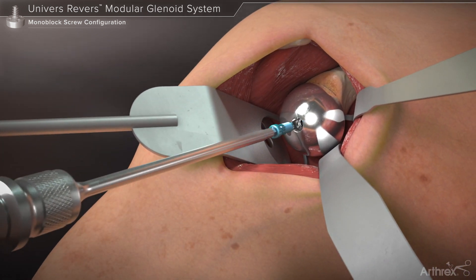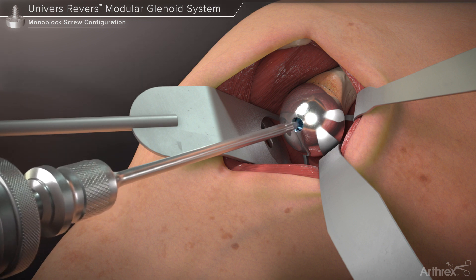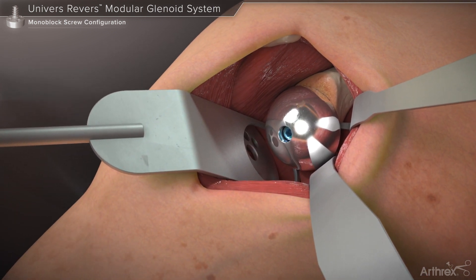Finally, the glenosphere locking screw is inserted through the threaded hole within the glenosphere and seated fully using the hex driver.